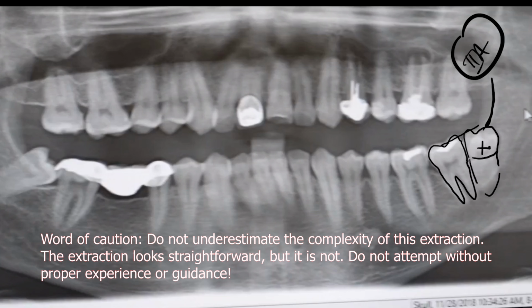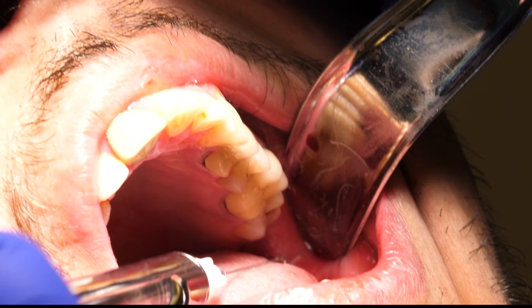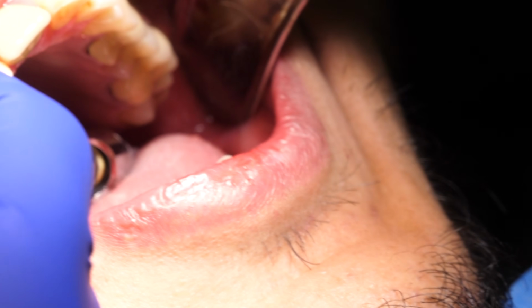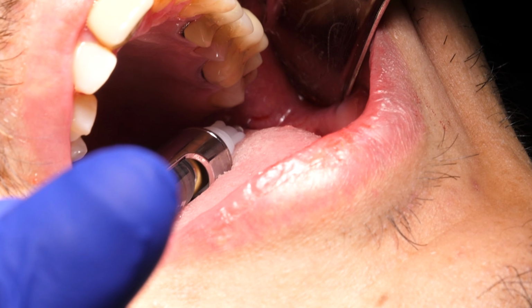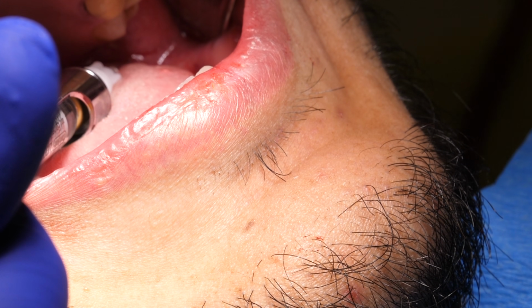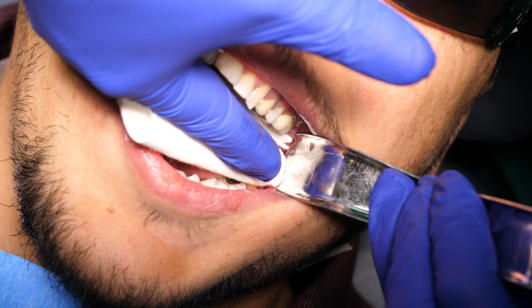Prior to the extraction, anesthetic was given for patient comfort. For specific technique guides, refer to the card on the upper right of the screen. In this case, 3.6 ml of 2% lidocaine with 1:100,000 epinephrine was administered through the inferior alveolar, buccal, and lingual nerve blocks. More can be given as necessary, but please be aware of the maximum dose for 2% lidocaine with 1:100K epi, which is about 4.4 milligrams per kilogram.